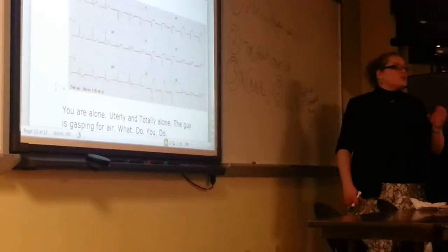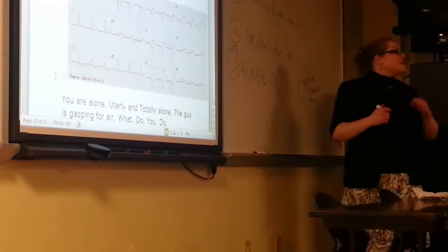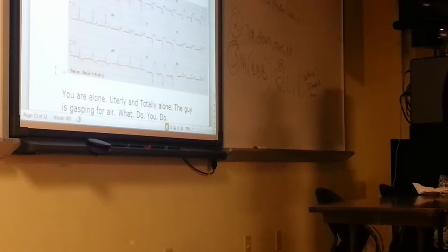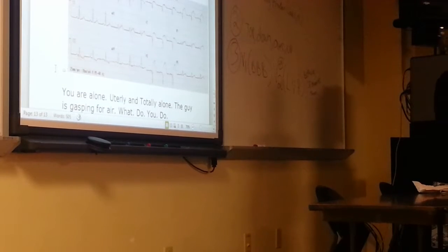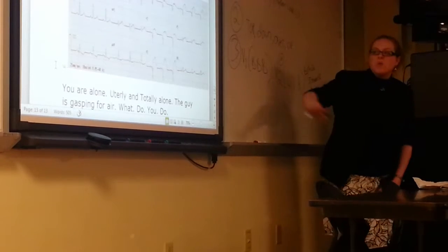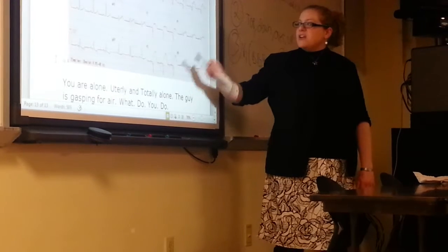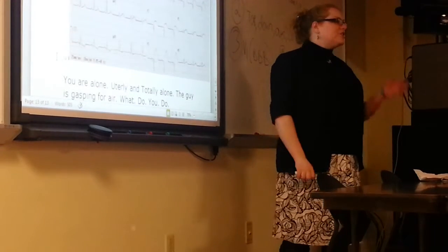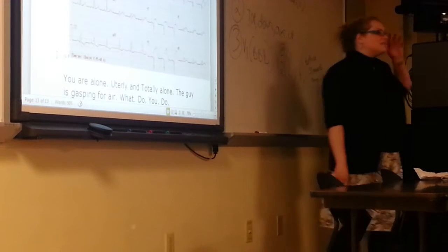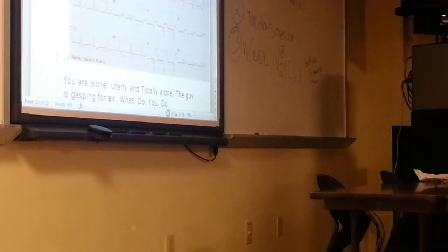Pericarditis is an inflammation or an infection in the heart, okay, that causes inflammation. Because the heart is not getting the oxygen that it needs, it can actually look like it's having an MI, but it's not. Okay? This is when you have ST segment elevation everywhere. The minute that you start seeing elevation, elevation, elevation, you need to start thinking, wait a minute, this could be a mimic. This might actually not necessarily be a widowmaker. This may actually be a situation of someone having pericarditis.